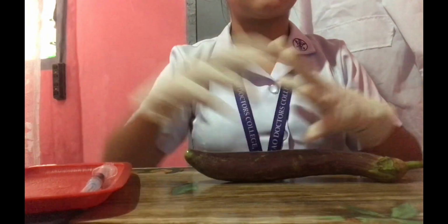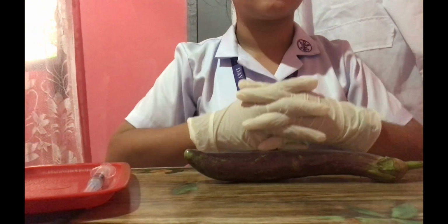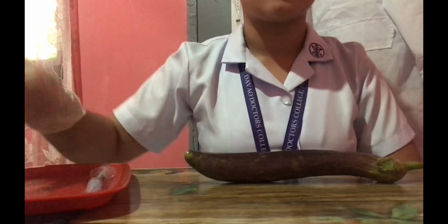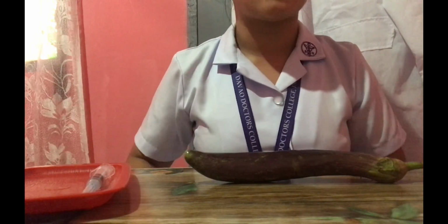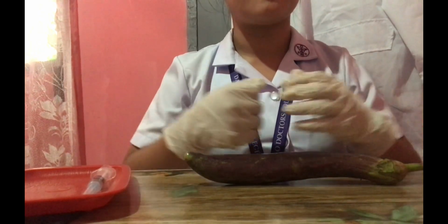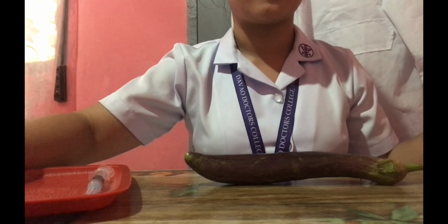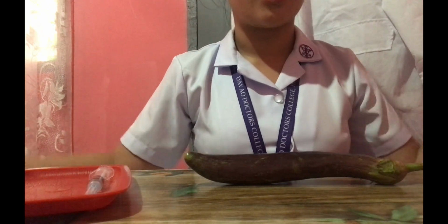Now for intramuscular injection, we need to select a site that is free from skin lesions, tenderness, swelling, hardness, or localized inflammation. If injections are frequent, alternate sites. Avoid using the same site twice in a row, but remember it should also be the exact site for the injection. So locate the exact site for the injection, then apply clean gloves, which I already did.